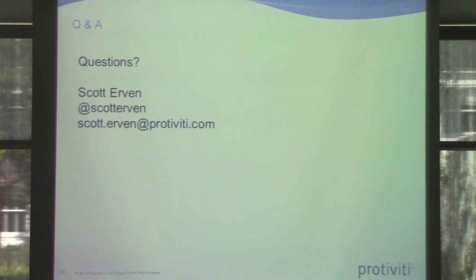And so there was, not to that, but to infusion pumps. I'm pleading the fifth, but I don't know what's in the article. The article came out from Jim Finkel, out of Wired, and Billy had done some research on a Spacelabs pump that he could go in and it had a hard-coded password for remote administration and could push forged drug libraries down to the infusion pump.